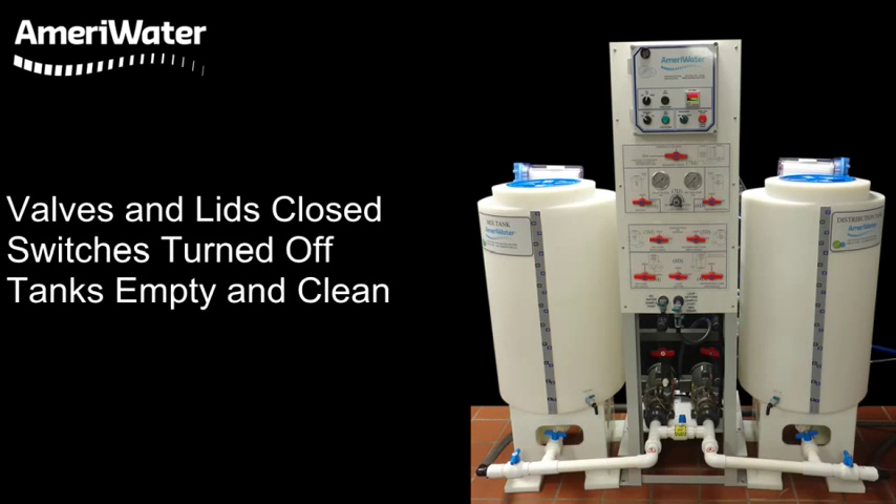Make sure all valves and lids are closed, switches are turned off, and both tanks are empty and clean.